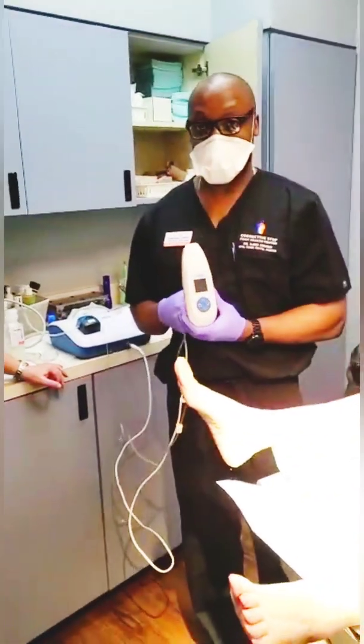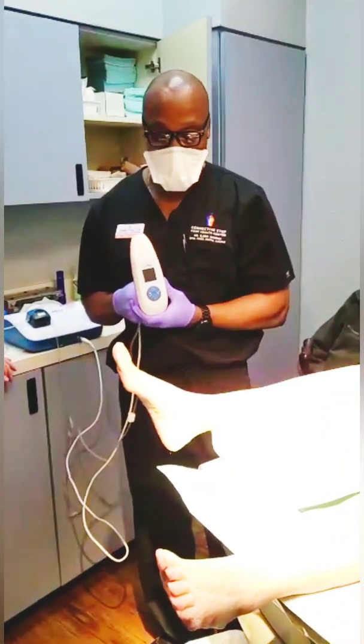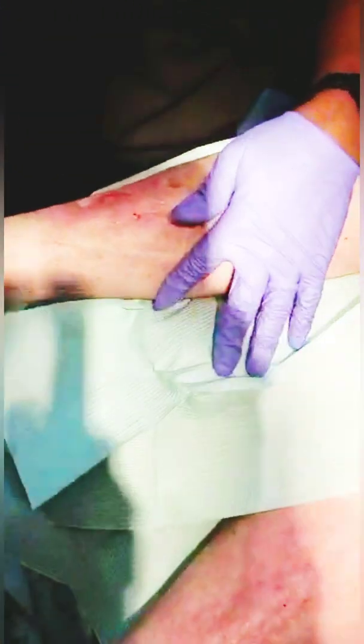I'm here with an exciting new device called Ultramist, from Sanuwave. It's basically an ultrasonic debridement device, and we're going to use this on our patient who has an ischemic wound secondary to scleroderma, secondary to a biopsy.